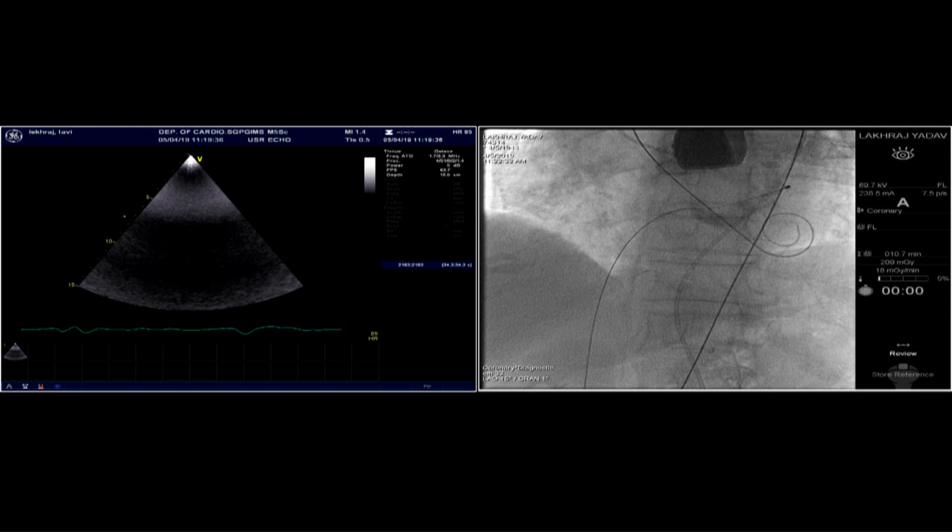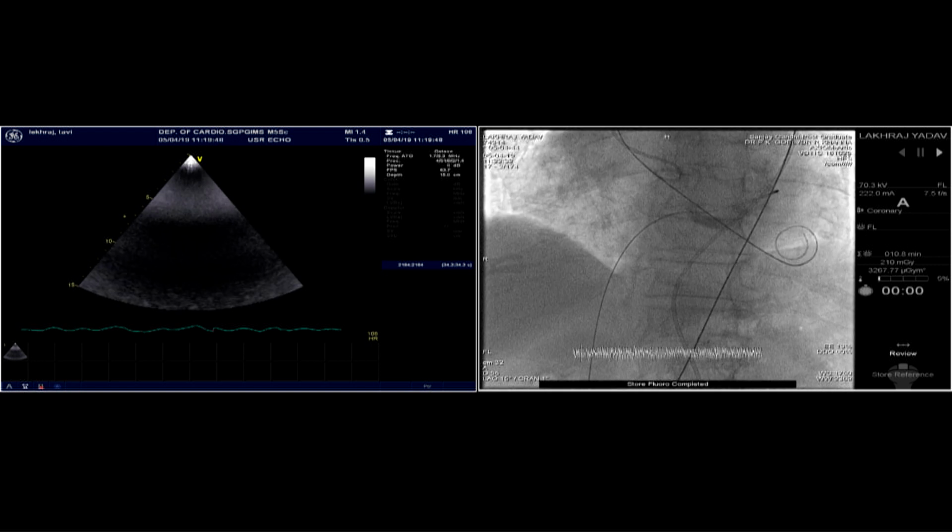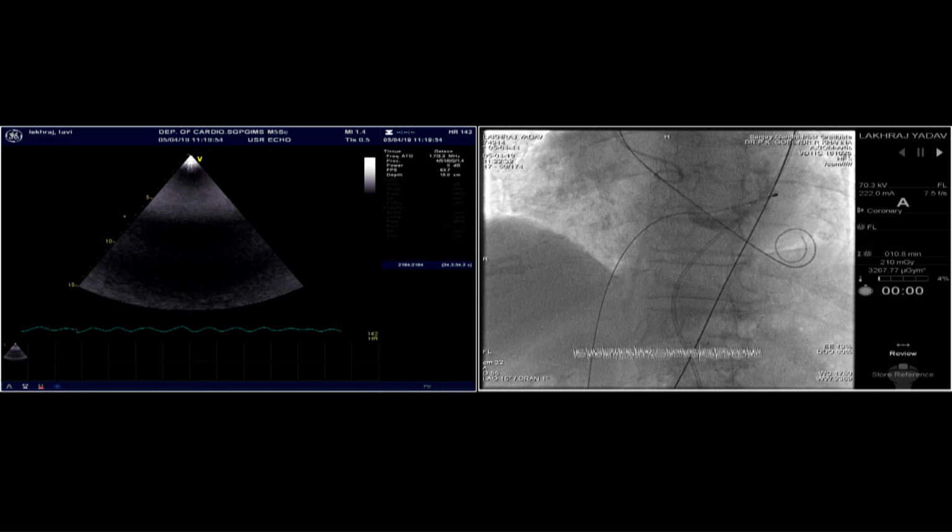There's no effusion. Let's move fast. Okay, come on. Let's get the valve in, please. But what rate is the noradrenaline going at? A small amount of vasopressor will help here. You've already dilated the balloon. Sir, I think we should deploy, sir.